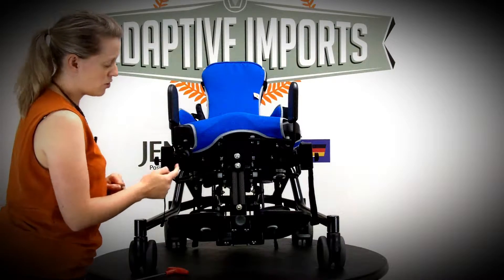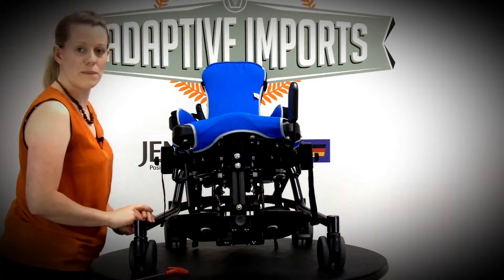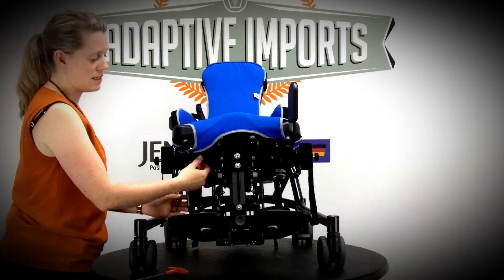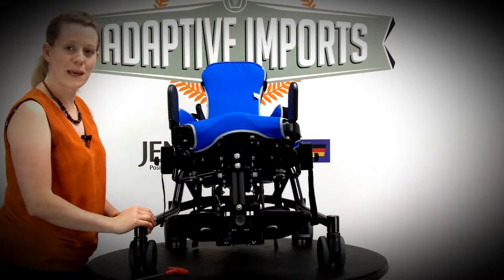These pads do flip out of the way. You pull the plunger, slide the pad back and that locks into place. That's great for transfers into the chair. Once you've got the child seated, pull the plunger and it pulls back up again.